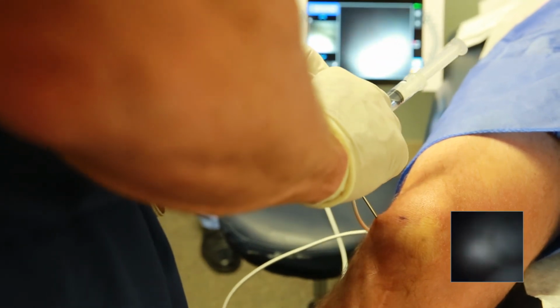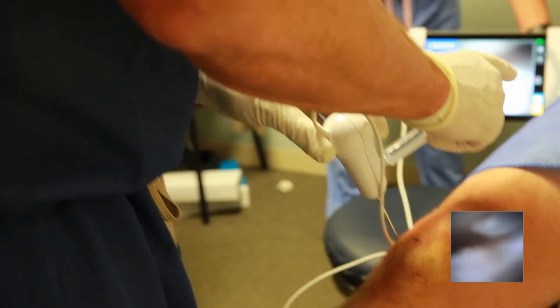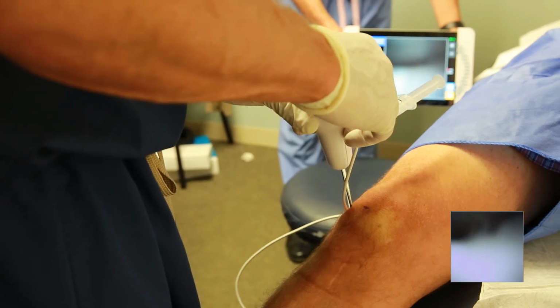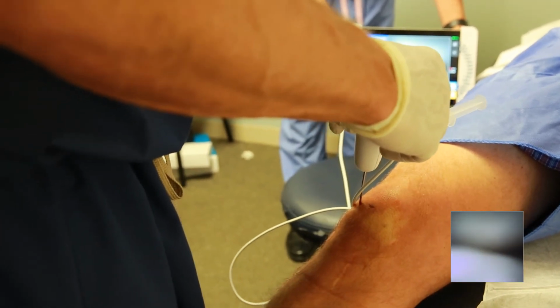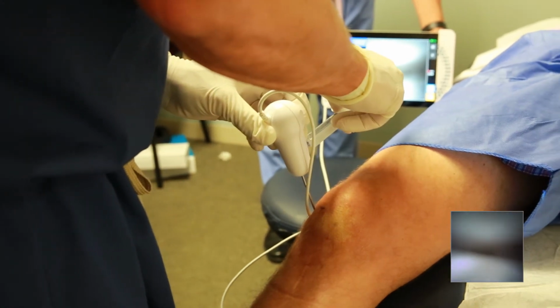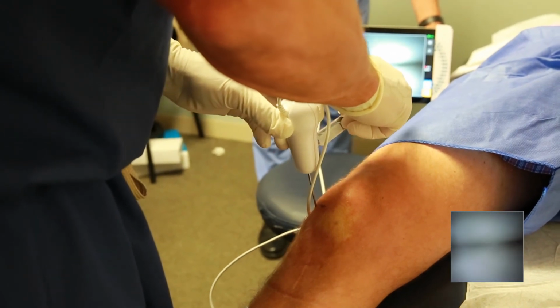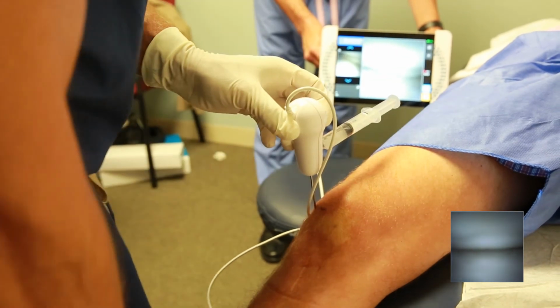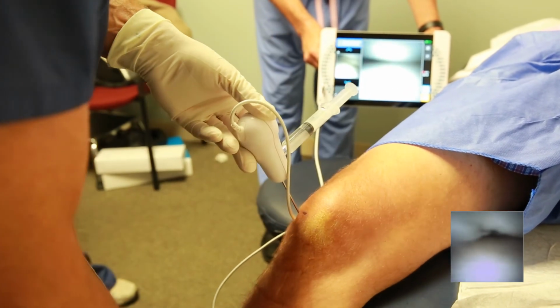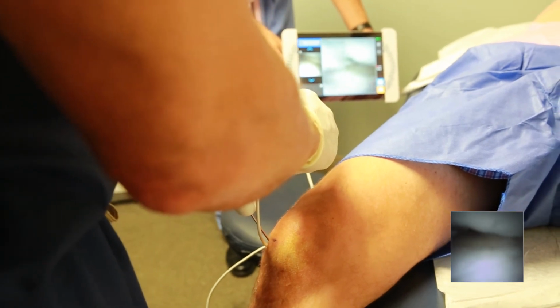And then if we pull back a little bit, there's his ACL. Again, we get a little bit of blood in the field. That looks good. And then laterally, you see that little bit of cartilage change. And now you can see why he's having pain. So Jason, if you look right now as your knee's bent, there it goes from normal. That's a big-time condyle defect right there.